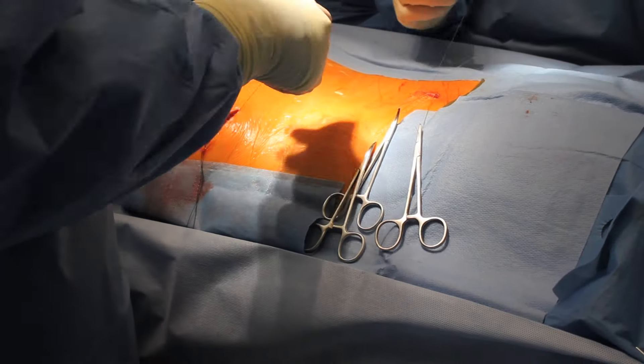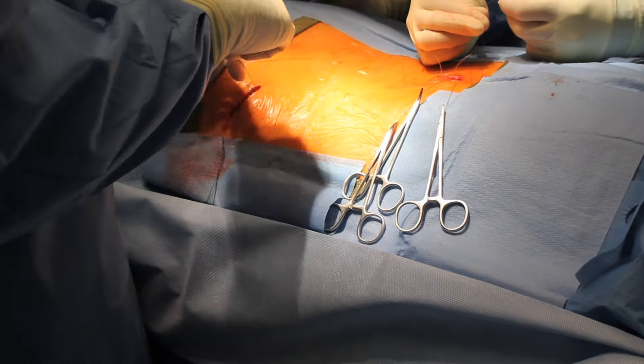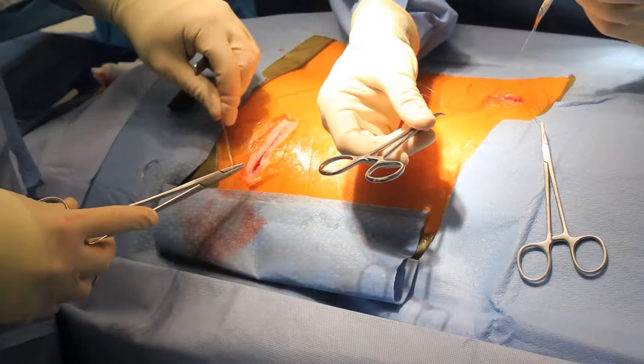Once it is confirmed that the device is in full working order, the incisions are closed in layers with suture material.